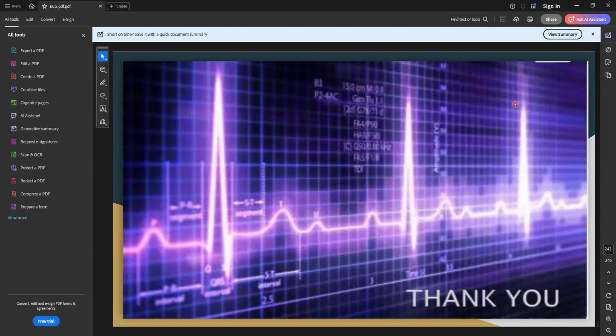That is the ST segment. What different types of MI have I told you? STEMI and non-STEMI. In those cases, the ST segment is one of the most important parameters you have to look at in the ECG. If there is any ST segment elevation, you have to look in more leads, like the anatomical groups I have told you, to see which leads show ST segment elevation and which show ST segment depression.